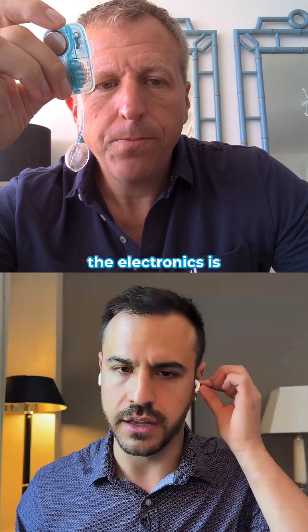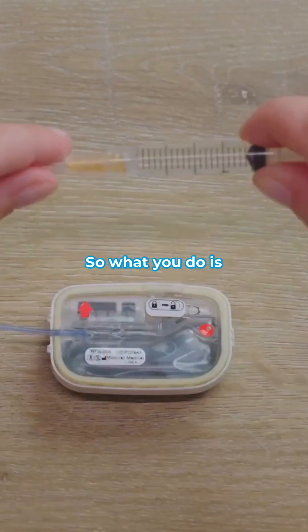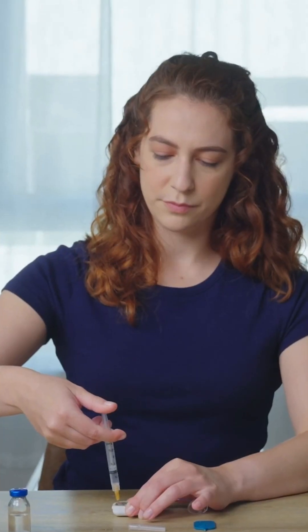The electronics piece is more of an outer shell that goes over the cartridge. What you do is take the syringe, which we provide with the kit, and use it to fill up the 3 ml reservoir inside the cartridge.